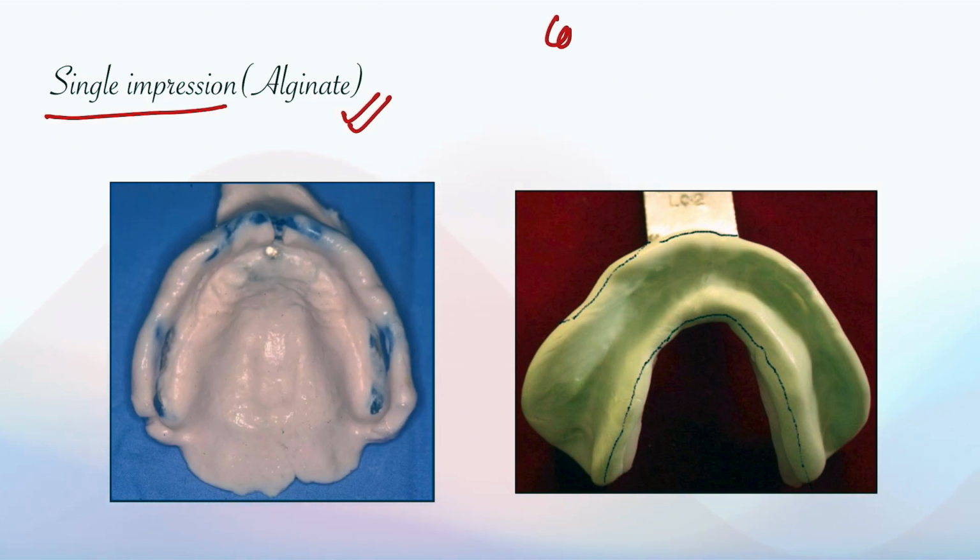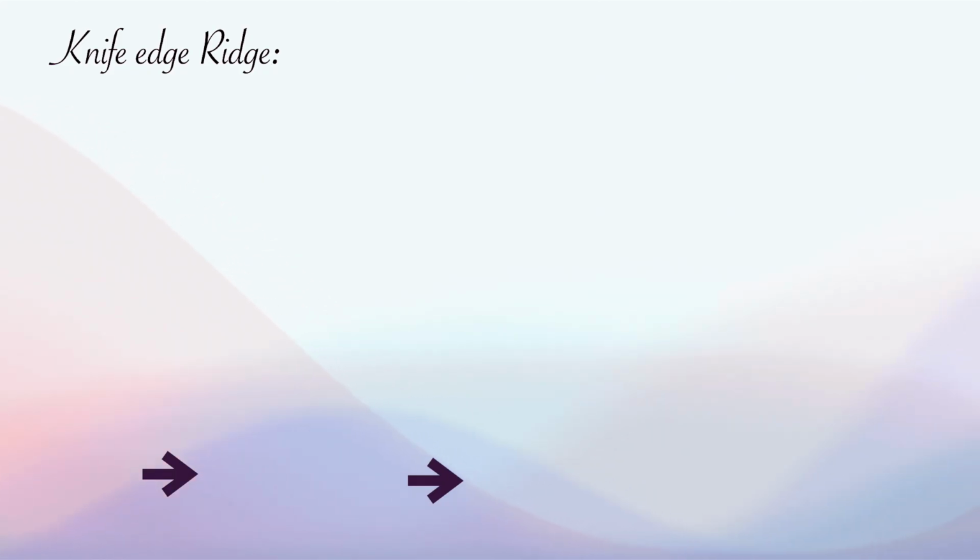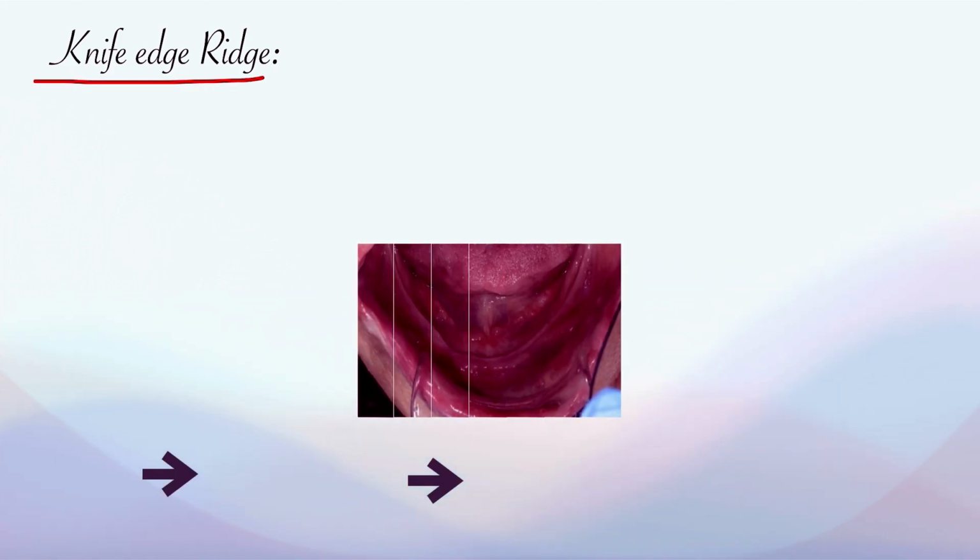This material is irreversible hydrocolloid. It is cost effective and most importantly, it requires good clinical skills and the consistency of material while taking the impression is very important. Another condition is knife edge ridge.